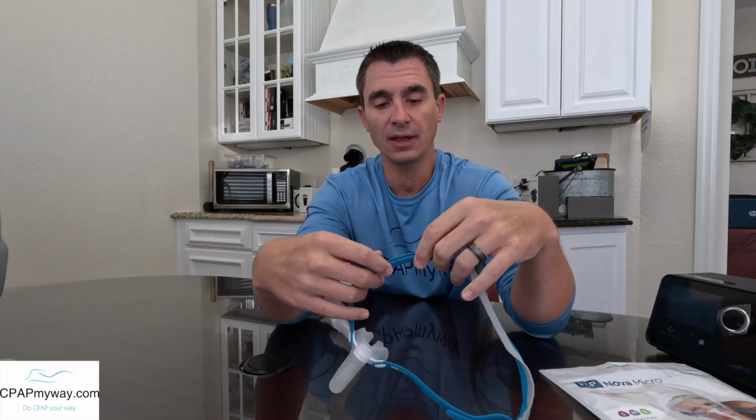It seems to be made very well, so I doubt that it's going to wear out quickly, but it is something to consider. The other thing is where the adjustments are here, right? These adjustments are going to be more up near your temple. You probably saw it, and hopefully I can take a screenshot and flash back to how it fit on my face.